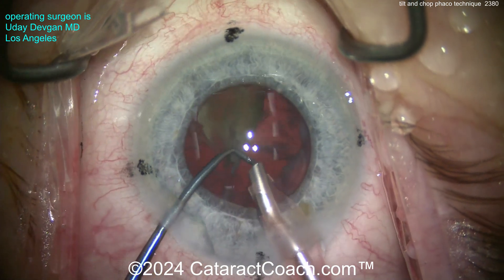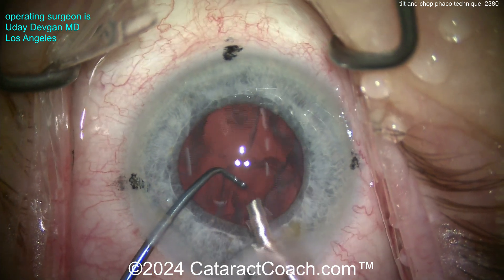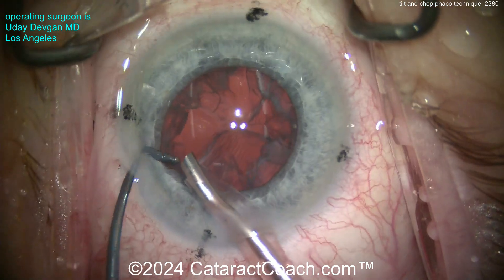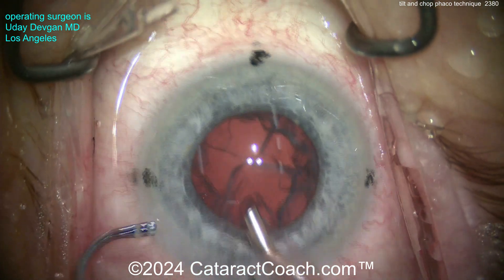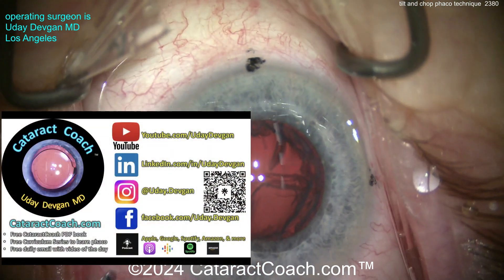Where does the chopper go in the safe position? Keep that chopper there to protect the posterior capsule — smooth back end of the chopper. There we go, last little piece — maybe one small fragment coming out of the eye. Time for the IA probe now.